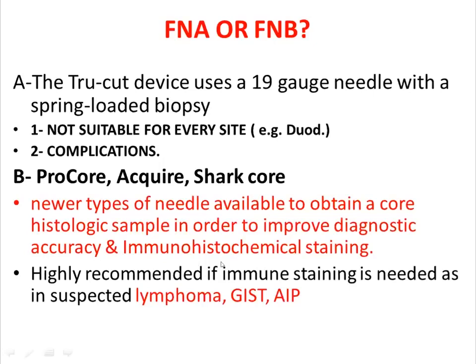In most of my patients, I use FNA needle because it is very manipulative, very easy to use, very easy to move with the lever, very malleable, very deformable. But in cases when I suggest that I need immune staining, I should do fine needle biopsy.